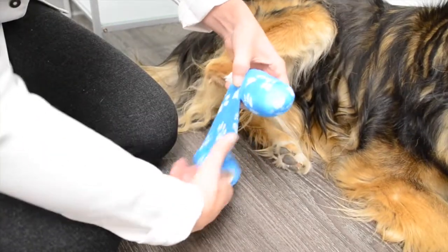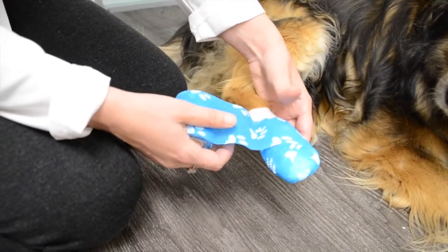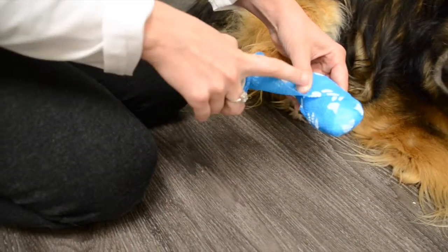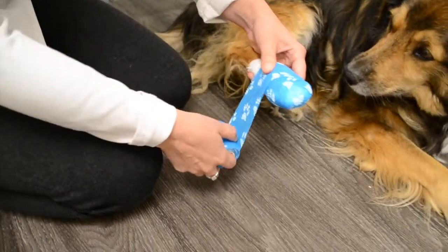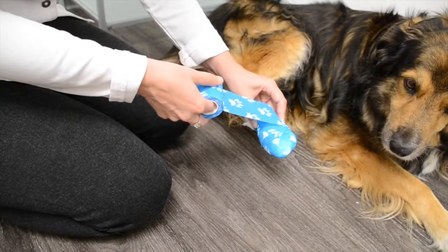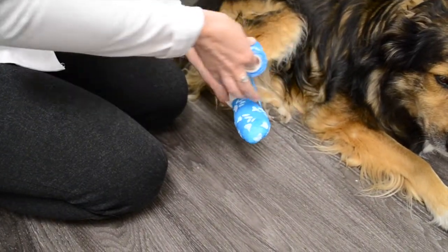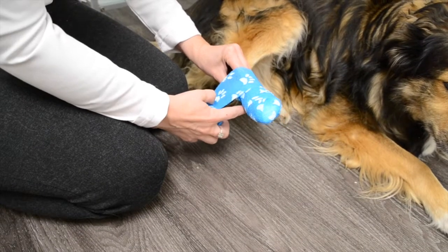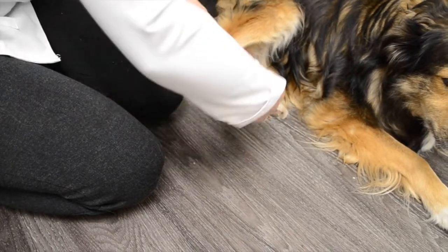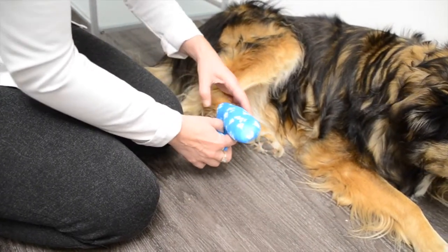And then we're going to just go from here. Now, the big thing about keeping this so it's not super tight is that a lot of times you'll notice I have my fingers on it at all times, because I'm going to stretch this out when I'm pulling it. I'm stretching it out against my finger, then I relax it and then you wrap it around, okay? If you're ever going to pull it, you want to make sure you anchor and then relax. Some people also like to stick their fingers in it, so they pull and go around with fingers in there, and once it's set, they take their fingers out, and now it's a little bit looser. So I just like the anchor because I feel like I can direct it a little bit better. So my fingers are always on it before I pull, relax, and there we go.